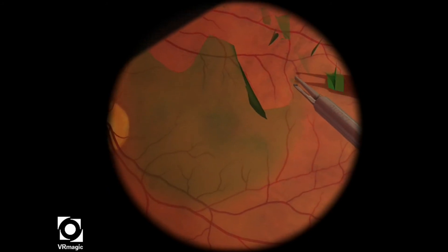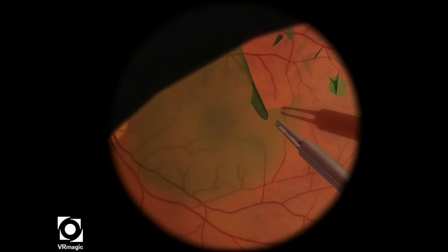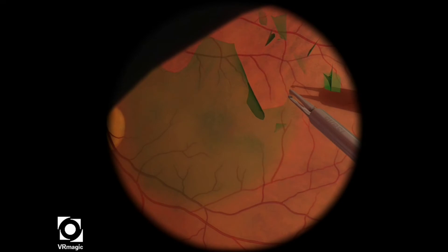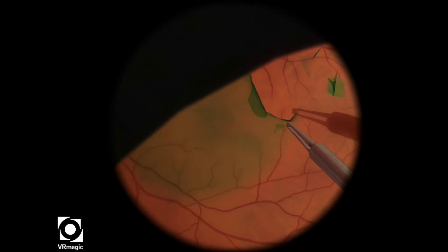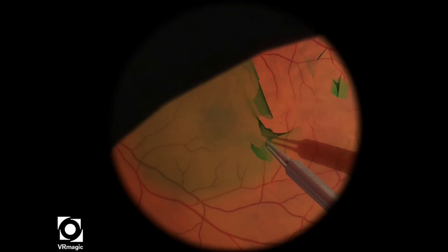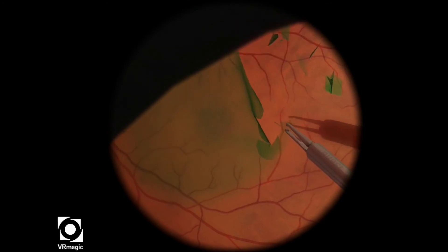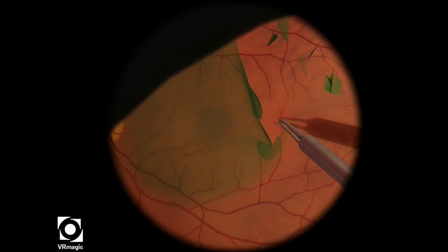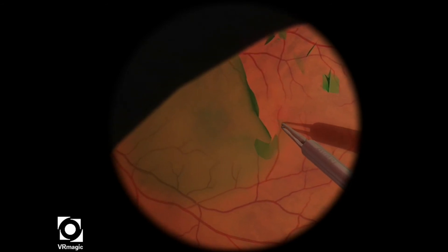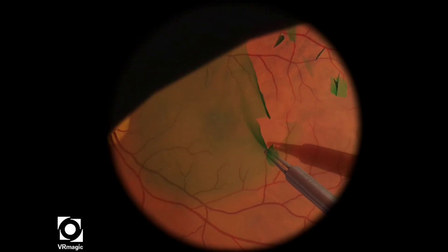I've gotten a nice large piece there now, and I'm trying to get these smaller pieces to continue the edge. I've gotten a large piece there, though I'm having a little bit of trouble with that small flap. So I change my mind and decide to continue on with the larger piece.